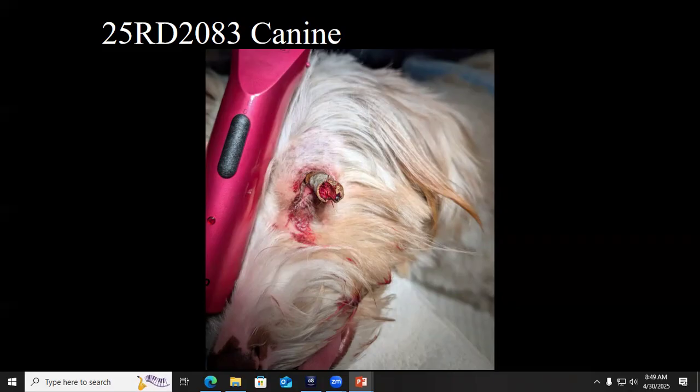And came with a history of trauma, large stick penetrated OS, no glaucoma, one day history. So we don't usually get a history of trauma, but if we didn't have a history of this one, I would have been very disappointed.